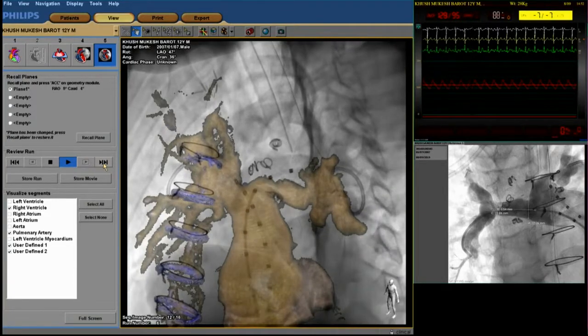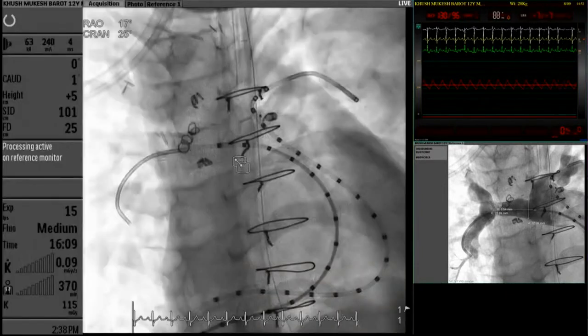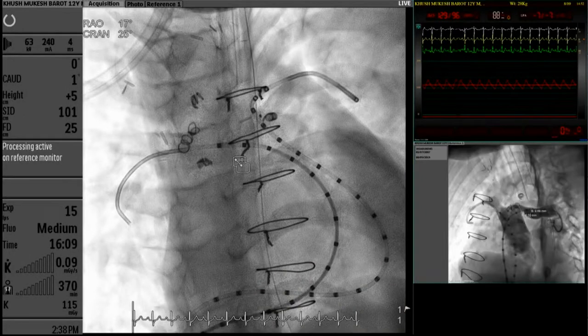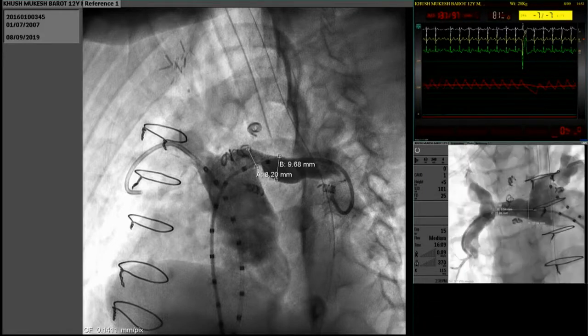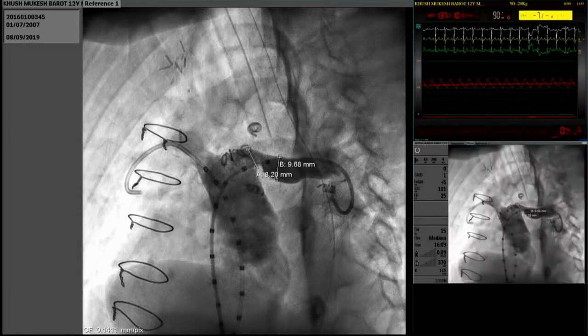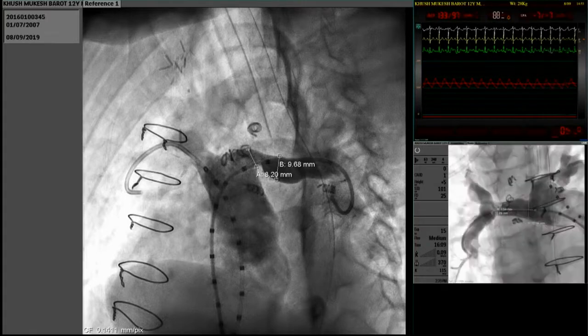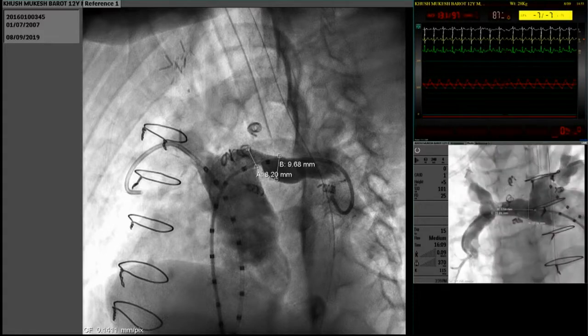The still photo of the LPA stenosis. Yeah, this was an oblique view of the LPA origin. Next picture, that's length of 27. Actually, if you go back, show me the left one. You can see that the left pulmonary artery has to be measured vertically, but has been recorded very obliquely. The left pulmonary artery ostium was somewhere around 4.5 millimeter in the same picture that I'm showing, and the entire length of the lesion was around 27 to 28.